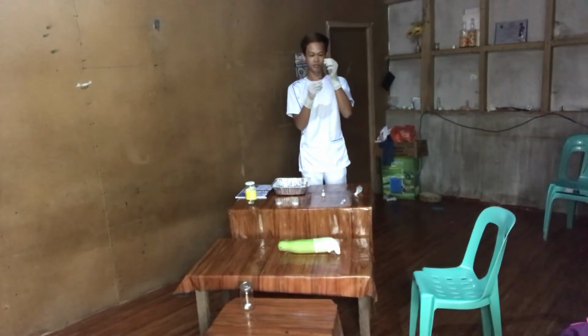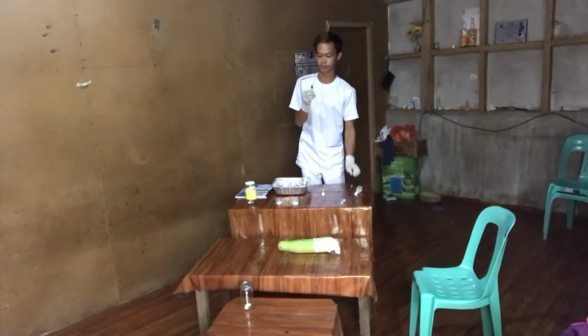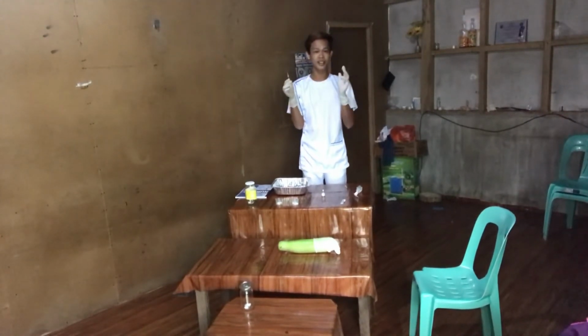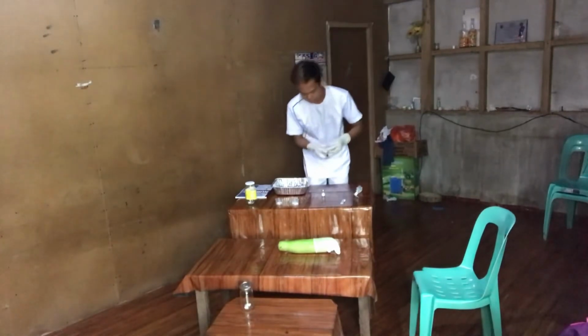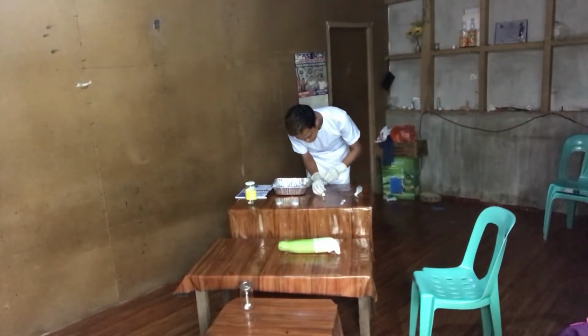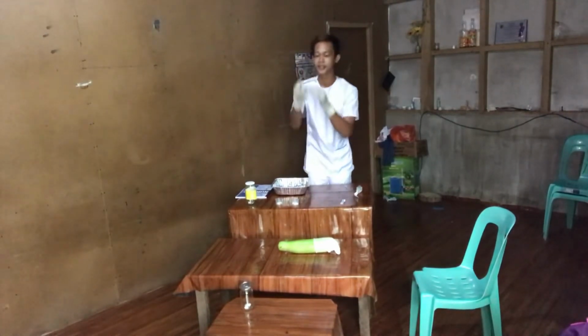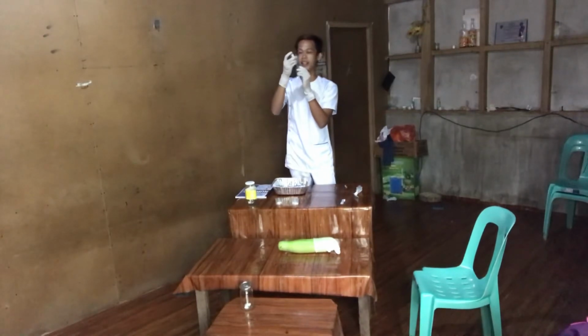Then inject the air into the vial. Then invert the vial and draw the exact amount of medication needed.